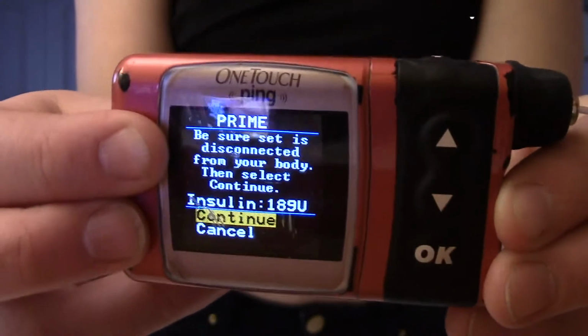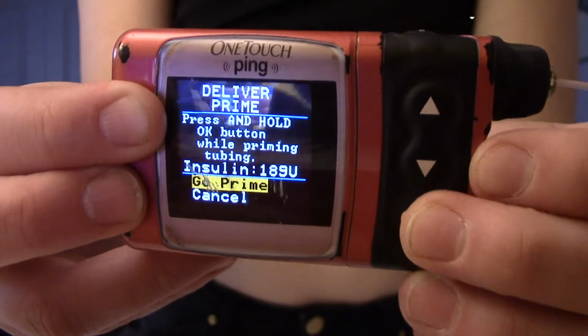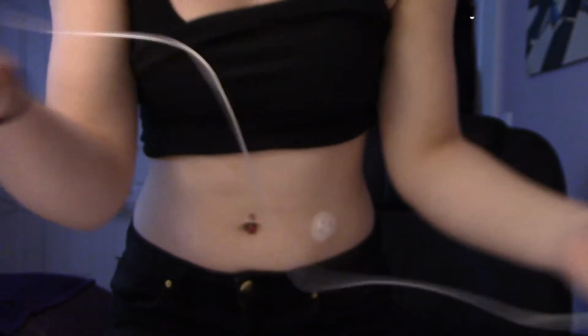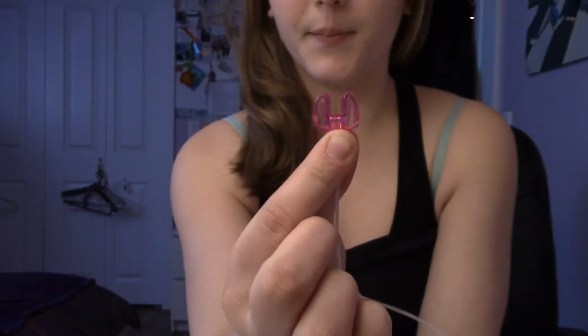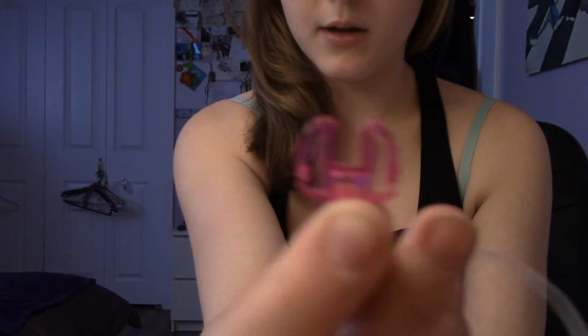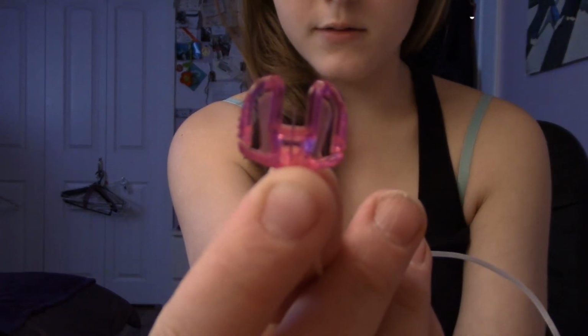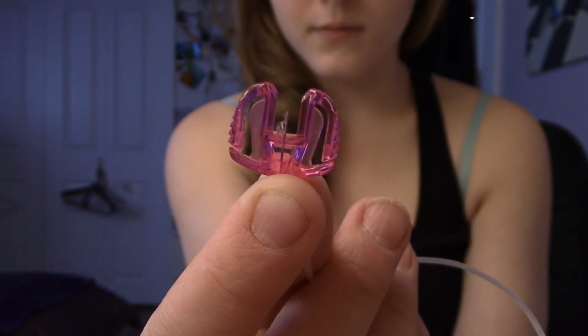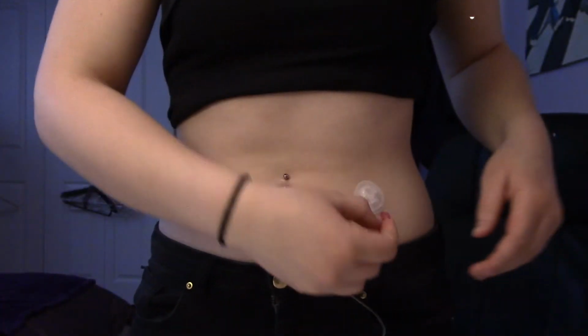Now I'm going to prime it. So you're going to press continue, and then I'm going to press OK one more time. But you want to make sure that your cartridge or your pink part's facing up, and you want to hold the OK button down while you prime until you see insulin coming out the top. So here it goes. All right, so now it is primed. Next thing I'm going to do is put it back into my insertion site.